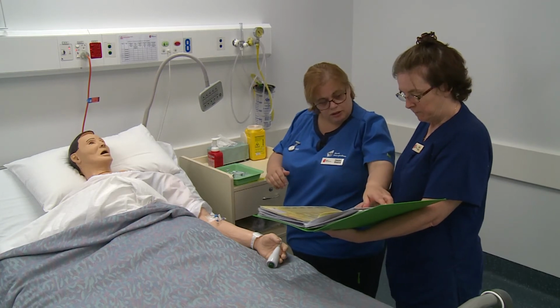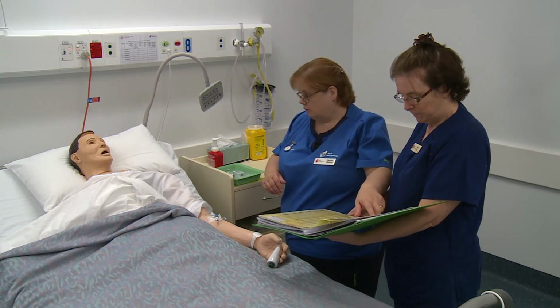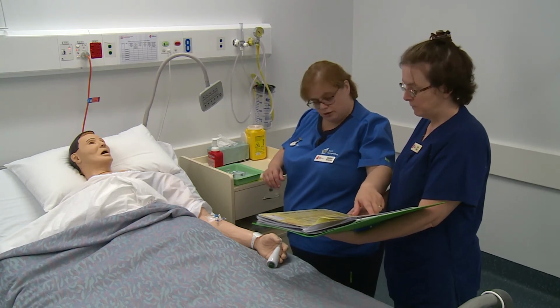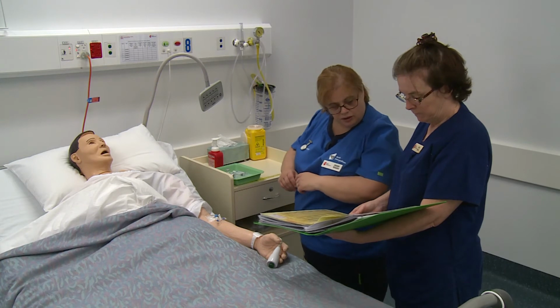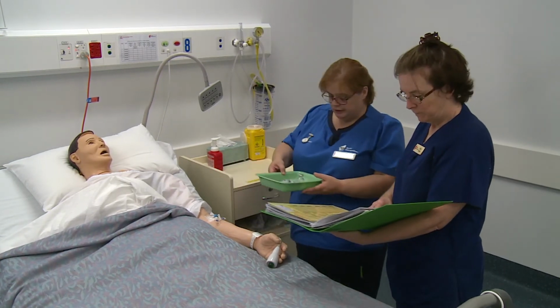So you're due your amoxicillin 1 gram IV and it's due at 12 o'clock and it's 12 o'clock now, so we're going to be giving you that. So I'm just going to be checking my medication that I've drawn up with my colleague.